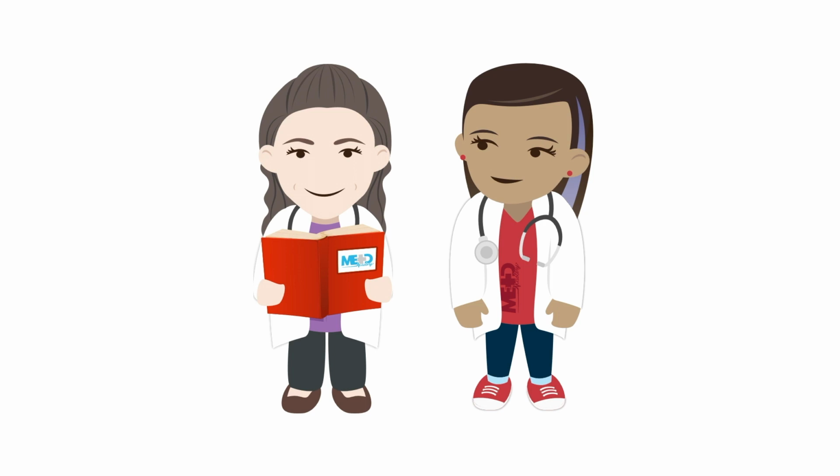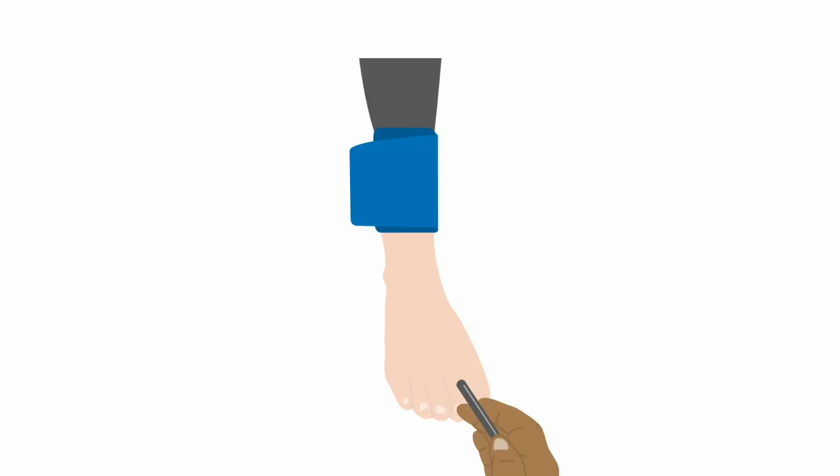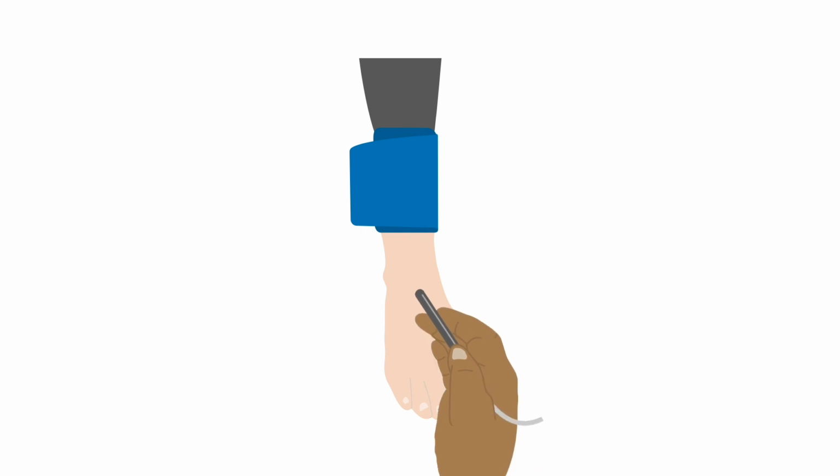Obtain the ankle pressure with the Doppler pen on the DPA. Write these pressures down. Obtaining this pressure is similar to the brachial pressure, only the systolic portion is recorded. If you have trouble finding the DPA at the anterior ankle, start in between the great and second toes and slide proximally in between the bones to find the pedal arch.